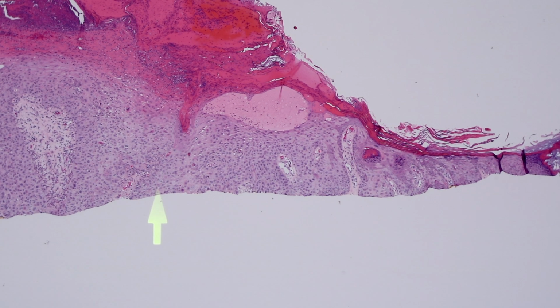And by the way, I don't usually report margins, I'm using air quotes, you can't see me, margin status on shave biopsies of basals or squames. And we did a research study on that with one of our former fellows, Alicia Schneblin, and we looked at things that looked like they had negative, quote, margins on a shave, but if we cut through the block, about 30% or more of them actually had positive margins. So I feel like really you can't reliably tell margins. You can know if it's positive, but you can't know for sure that it's negative reliably on a shave.